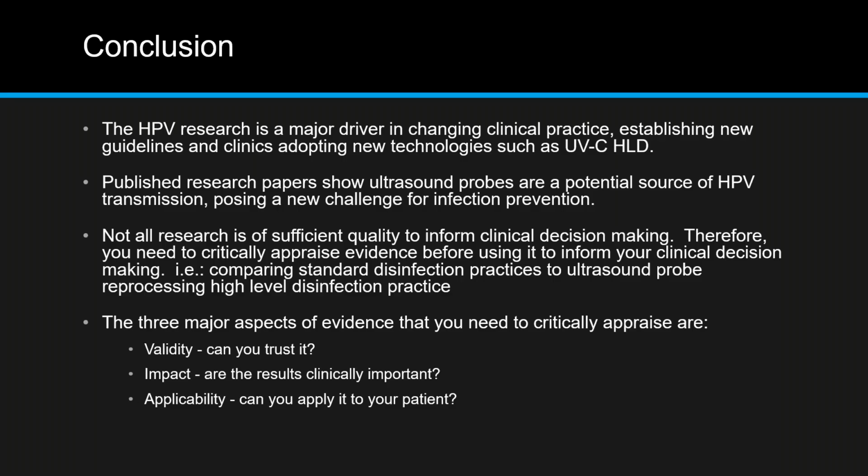Published research papers show ultrasound probes are a potential source of HPV transmission, posing a new challenge for infection prevention. Not all research is of sufficient quality to inform clinical decision making. Therefore, you need to critically appraise evidence before using it to inform your clinical decision making, i.e., comparing standard disinfection practices to ultrasound probe reprocessing, high-level disinfection practice.